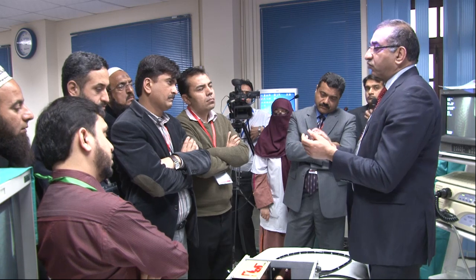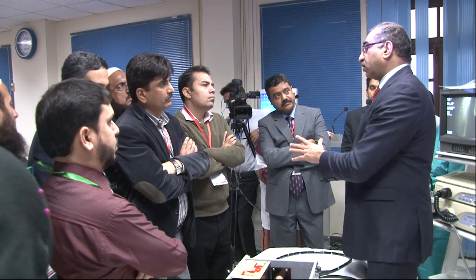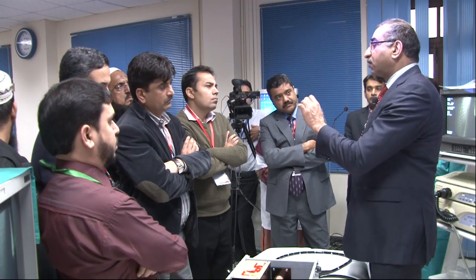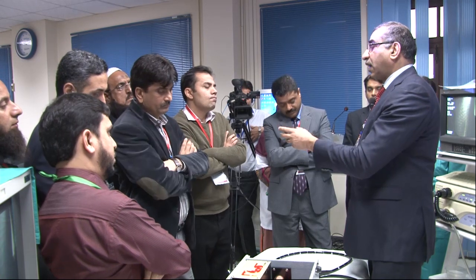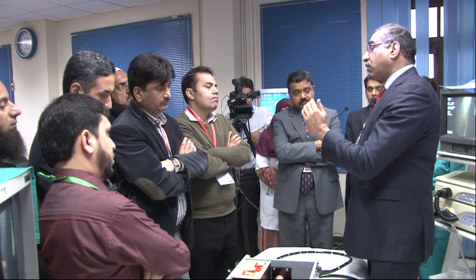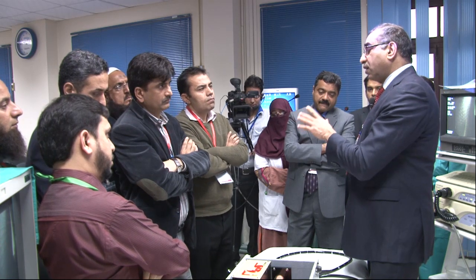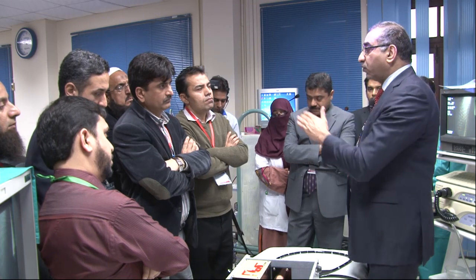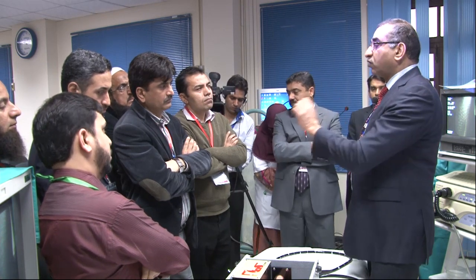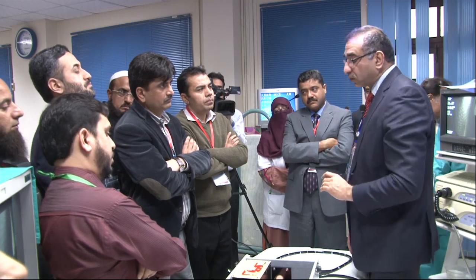Otherwise, as you saw very elegantly in the presentation by Dr. Khalid, you could actually see the orifice. And sometimes with cannulation, you just have to wait for the right moment, especially when it's moving with respiration. So try not to probe it unnecessarily, until you capture it and then go, right?